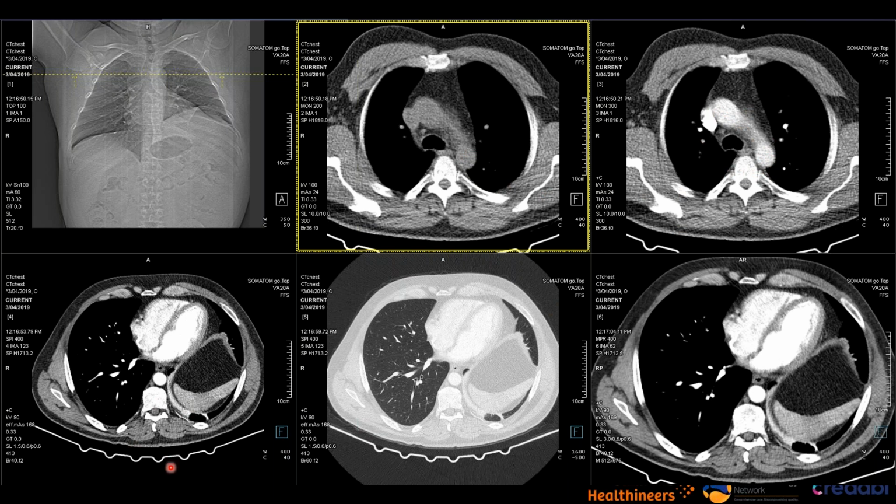We have our thin data set here, thin data set of lung window and lung kernel, and then we've got our 3 mil slices at the end here.